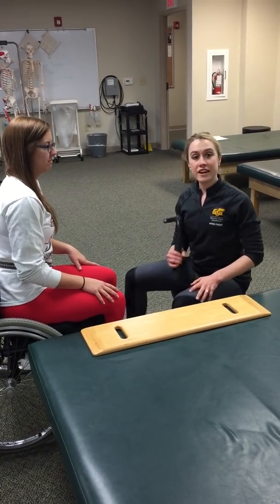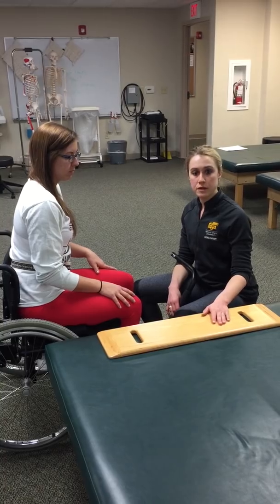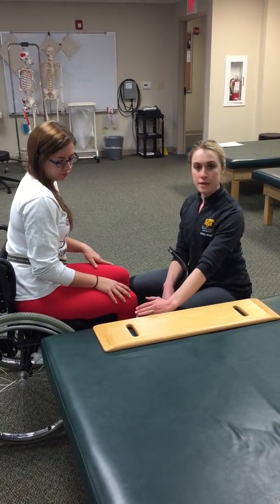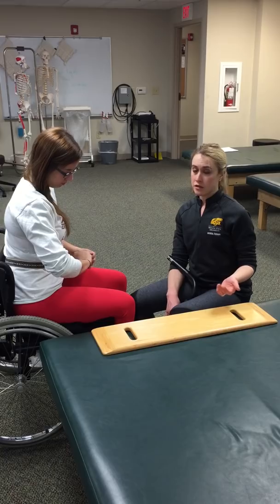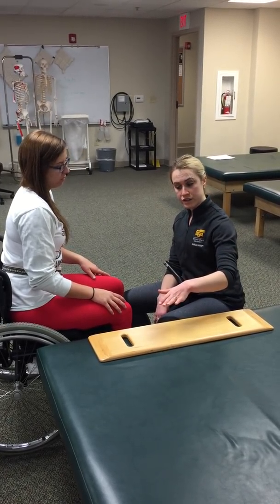We're going to demonstrate, Claire and I here, how to perform a sliding board transfer from a wheelchair to a mat table and then back again from mat table to wheelchair. Again, your surfaces may not be set up exactly like this when you're doing this transfer with someone. You could potentially transfer from a couch or, depending on if you're in home health or a hospital bed, you might have a height difference in surface.